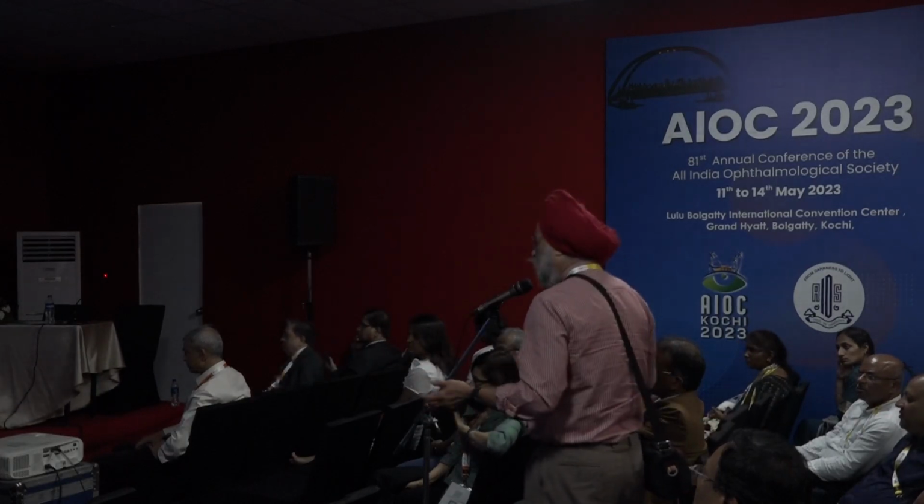Thank you. Some new things are coming up because things become so easy and so clear that you are able to do so many things. You take a hard cataract with a high vacuum and you go behind, you engage the corner of it, and you will break it without damaging the endothelium and the posterior capsule.